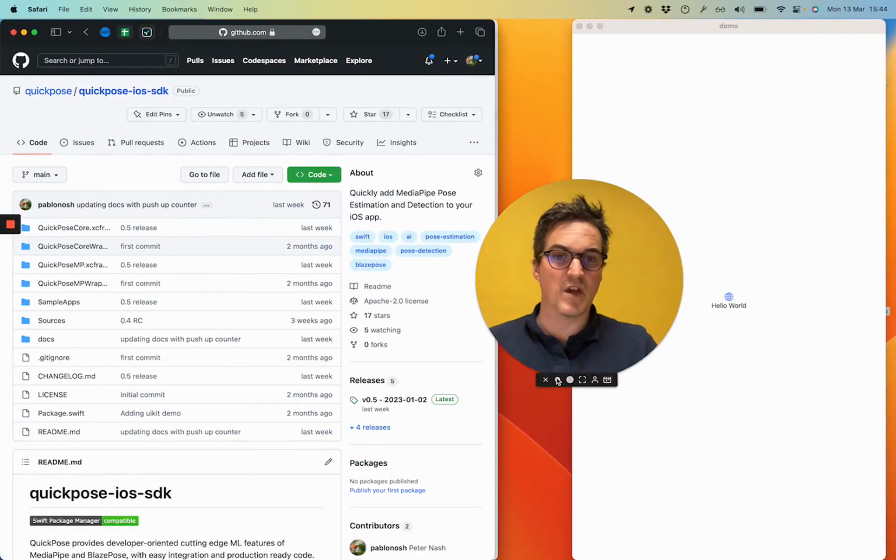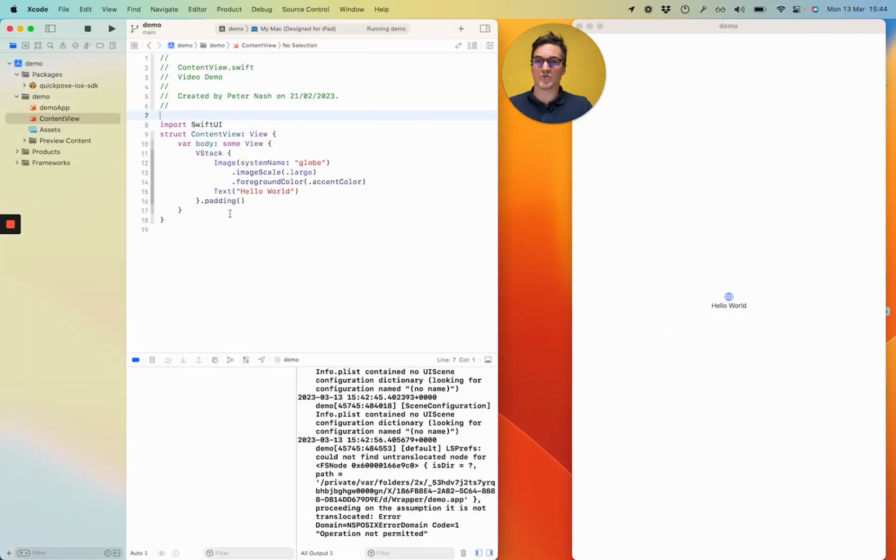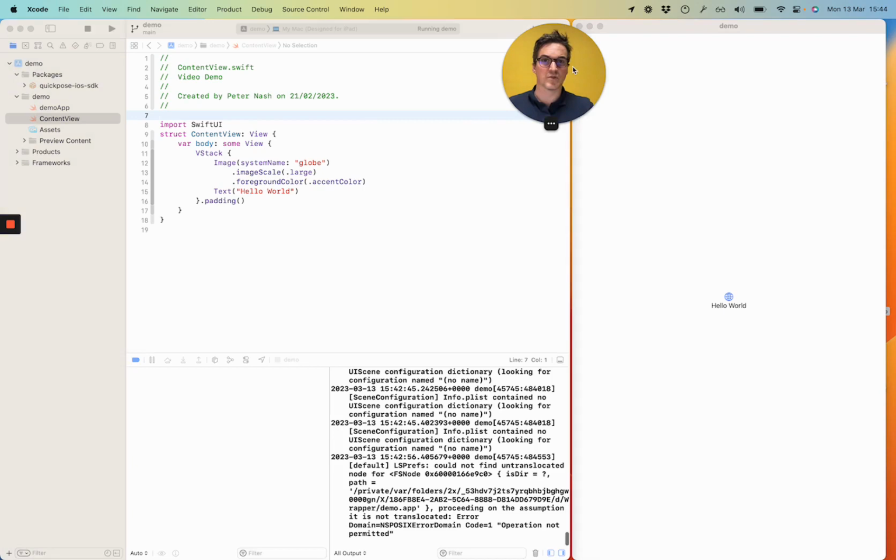The video today assumes you have downloaded the QuickPose iOS SDK from our GitHub. You use Swift Package Manager to do this. I have got the bare bones Apple app here, which comes when you create a new project in Xcode. And when I run this, I just get this hello world on the right. You can see here I've also installed our SDK via Swift Package Manager. So I'm just going to do a tidying up.